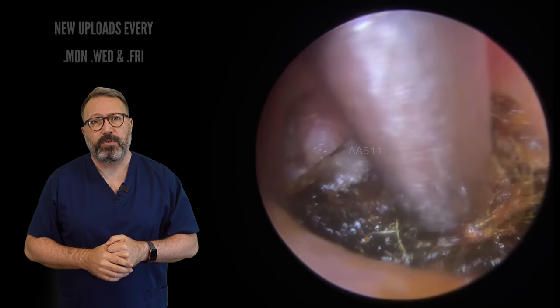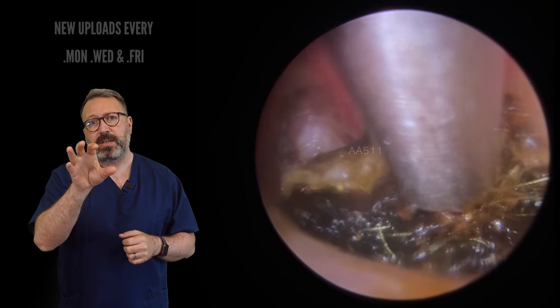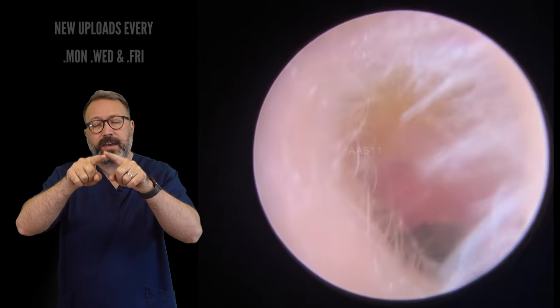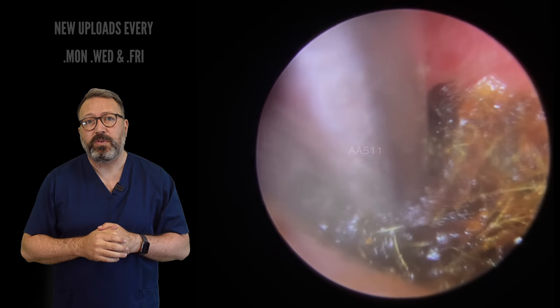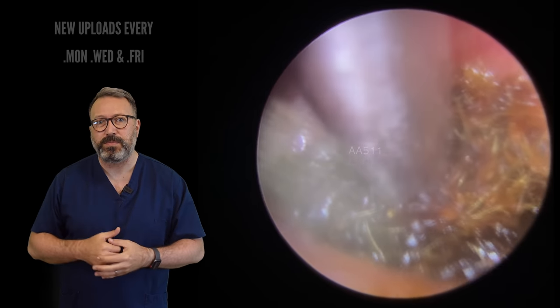We're going to have to employ a little bit of wiggling. We can just about see the eardrum there. We can just see the hammer bone. We can see all the pink blood vessels coming down into the centre — that's the tip of the hammer bone there. And then on the left-hand side, you can just see the top corner of the eardrum. So we're starting to uncover the eardrum. The patient had started to hear better at this point.